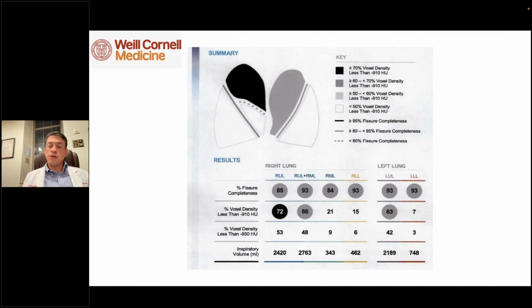We're very excited about this case because we can really expand the left lower lobe and have that left lower lobe take over. And because it's so healthy, we think that the patient will do great. But let's imagine this lobe was not so healthy, then I would be concerned because I'm asking a lobe that's only 700 cc's to fill the space of almost 3 liters. So over time, with clinical experience, you start to better understand which patient can get away with this and have benefit versus which patient will get into trouble with air leaks and a space issue.